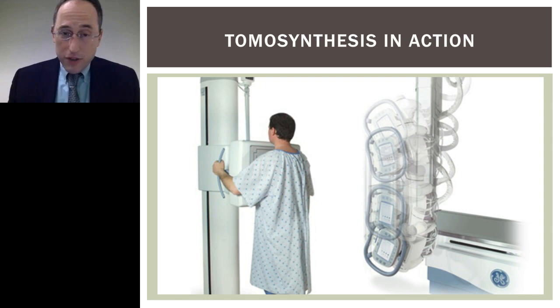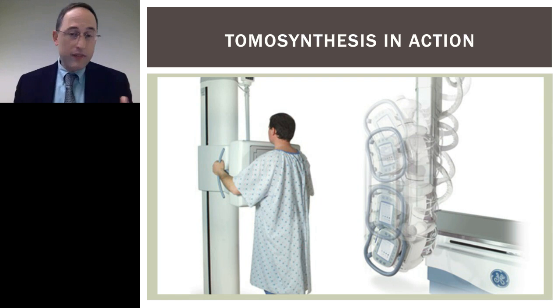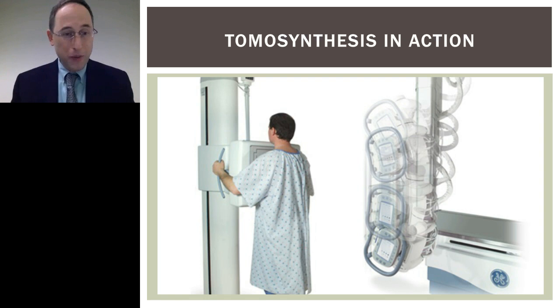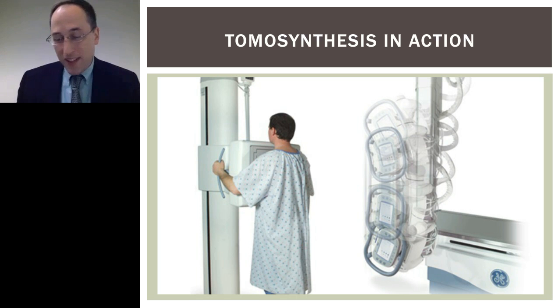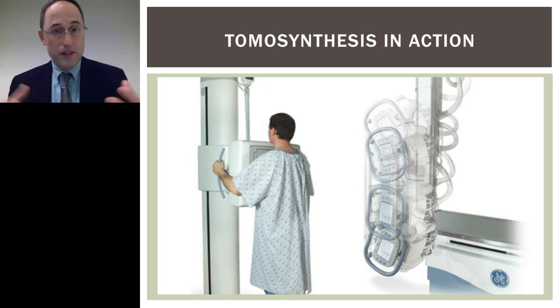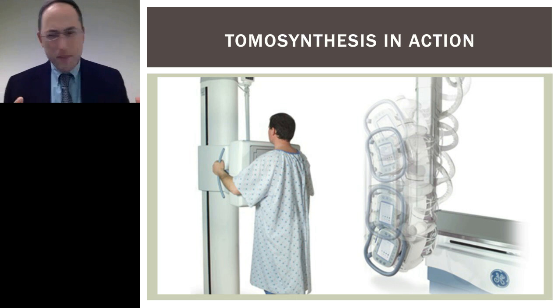They look very similar to a chest radiography setup, and in fact, in many cases, it's identical. A lot of institutions have this system installed, and all that's required is a very small software upgrade to make it capable of producing tomosynthesis images. And so, of course, it makes it a low-cost modality compared to CT, because the instrumentation is much cheaper than CT. And there's a lot of flexibility in terms of the way you can position a patient.